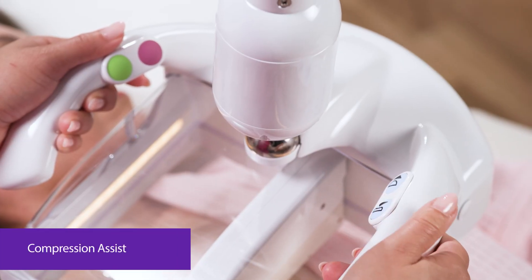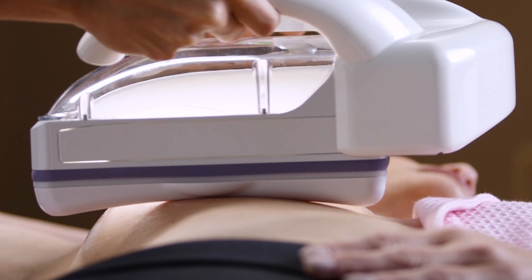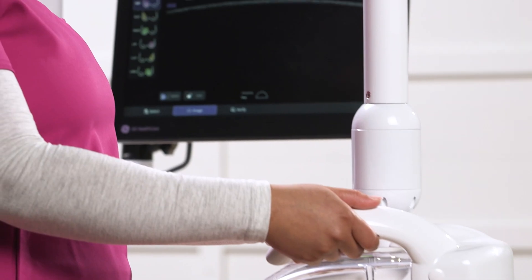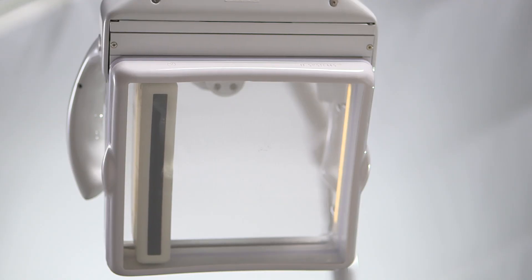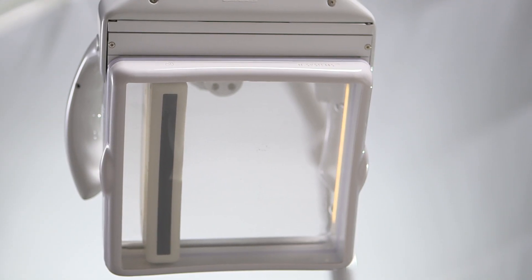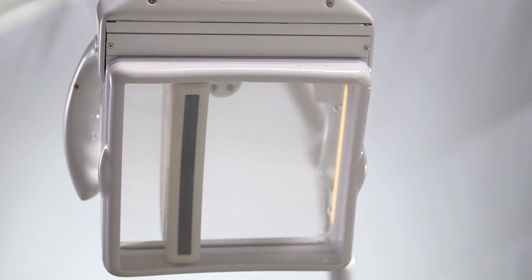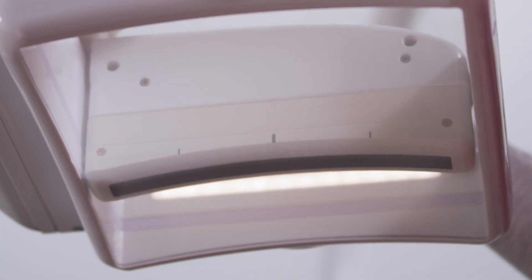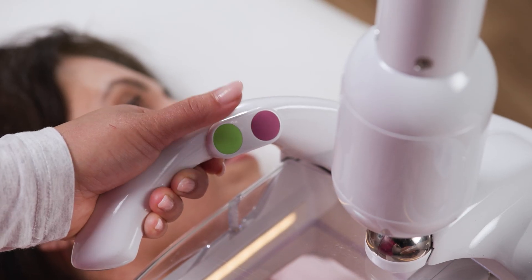The compression assist feature is used to set the pressure to one of three levels to ensure the patient's individual comfort level and the ergonomics for the operator of the exam. The scan head assembly houses the 15.3 cm reverse curve transducer, which conforms to the female anatomy, enabling outstanding patient experience and excellent image quality.